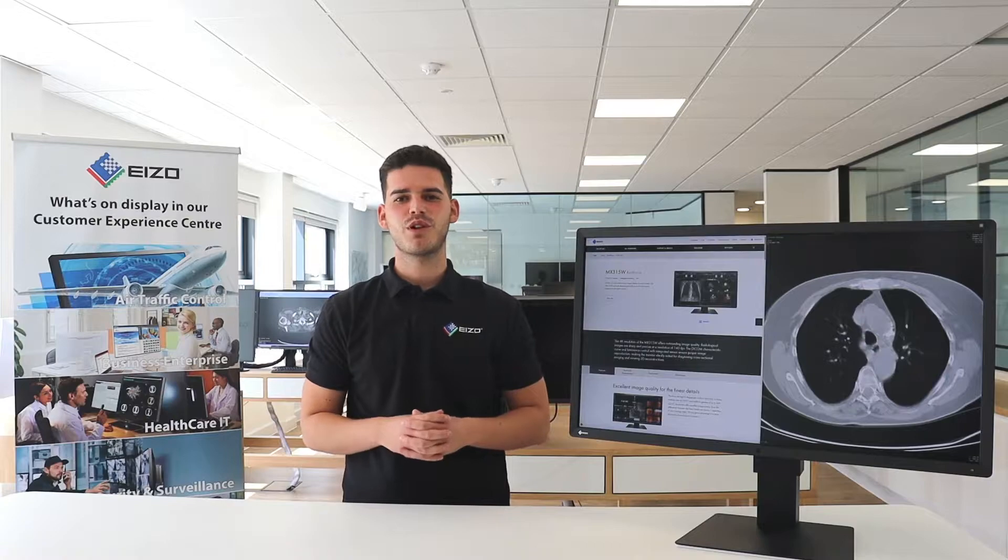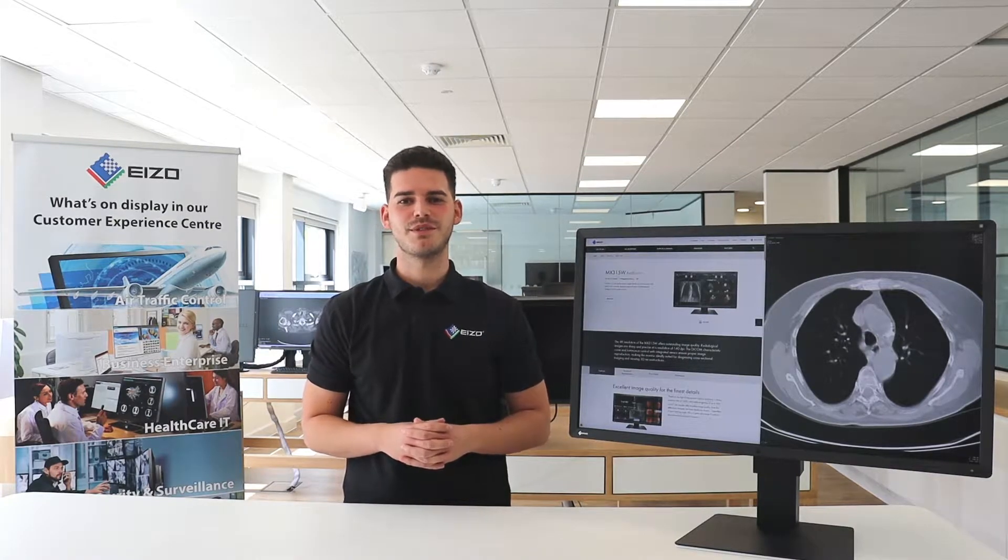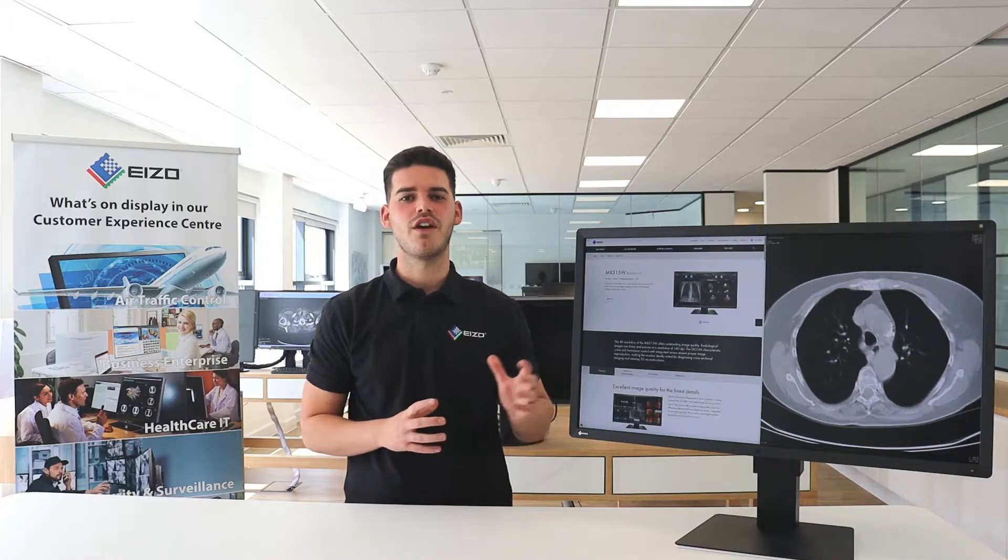Hi, I'm Rob Cooper, Product Specialist for Medical Solutions at EIZO Ltd. Today, I'm going to demonstrate our RadiForce MX315W.